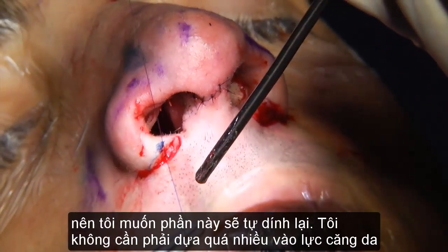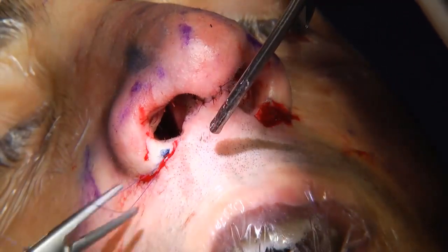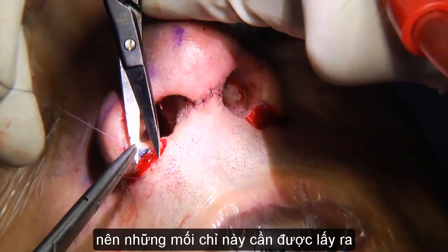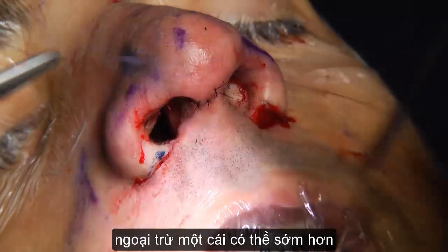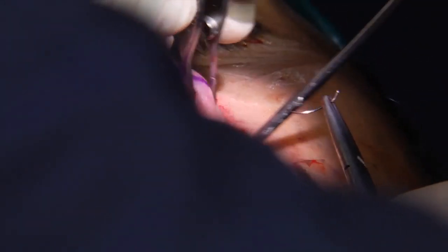I really don't want to depend on the skin tension. So these sutures have to be taken out, except one maybe early. It's a sebaceous oily skin here.